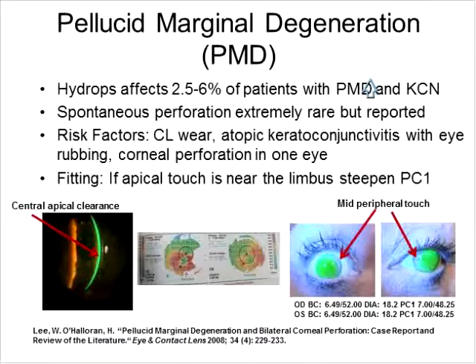So in the number of microns, I'm sort of estimating how many microns are under the lens. I'm not imaging the lens in my practice, but I guess I would say an even amount of a tear reservoir under the lens. And that's a tricky question if it's better to have more than less. Of course, you don't want any touch, so you don't want not enough clearance. However, there can be complications with excessive clearance as well. So again, somewhere in the middle.